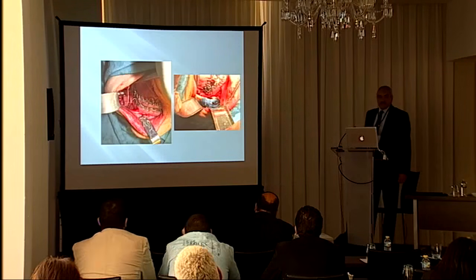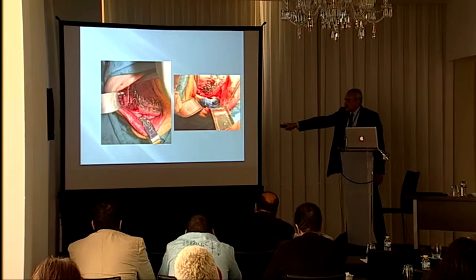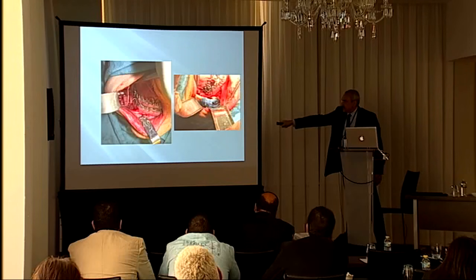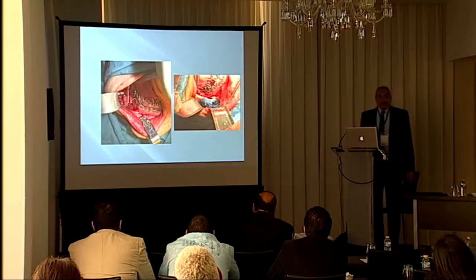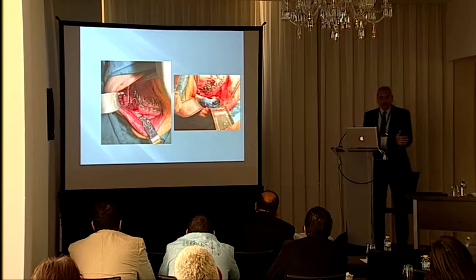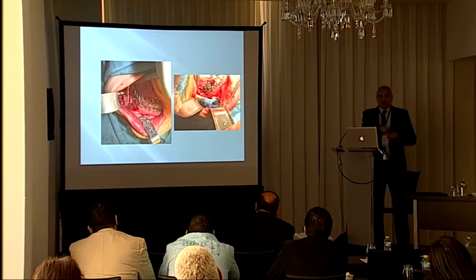This is what happens in the operating room at surgery time. We can see this actually. This is a blue line. This one is transparent. I don't know if you can see it or not, but actually, especially in setbacks, I found a gap in between the segments. We always, when we try to position the condyle, use what we call the transbuccal trocar, that we use to drill through and place the screws, and we put the bone segments together and we press them on each other, so they contact each other.